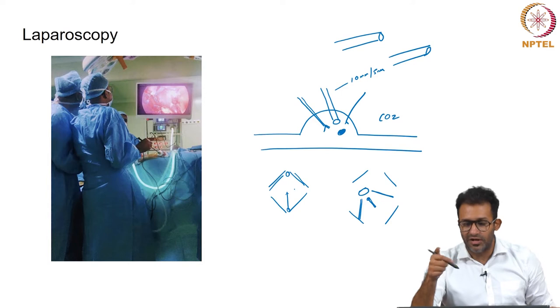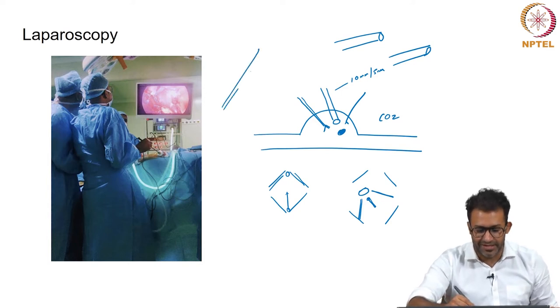In fact, what we call laparoscopy is straight stick laparoscopy. So your instruments are like this.